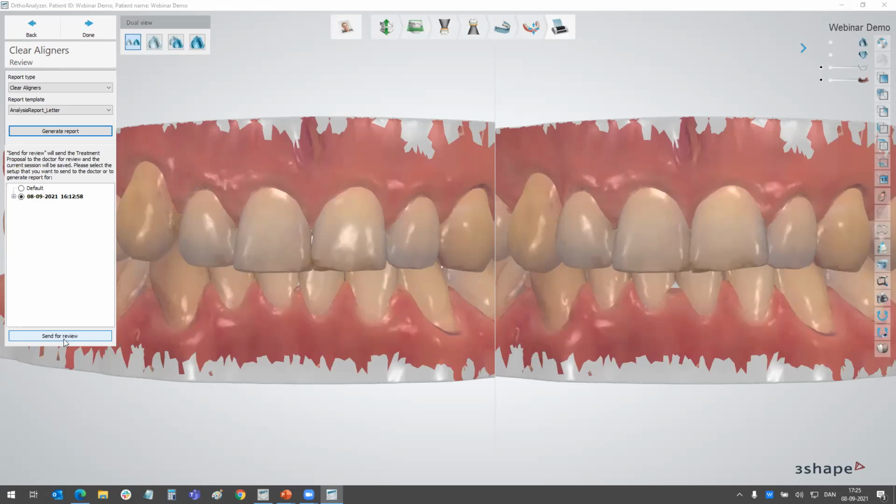There's a question if it's an add-on to dental system. I actually don't know if you can buy it as an add-on to dental system. I also don't think so. I think we only said that you can get it if you get the scan only, ortho analyzer, or premium. But we can definitely check and then get back to our sales management, and those guys can let you know. Thank you for the question.